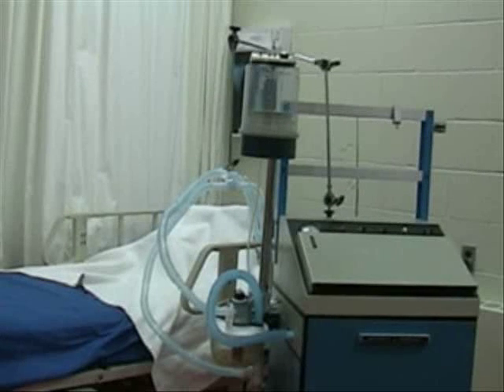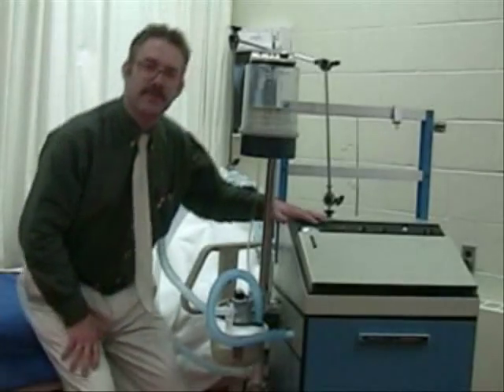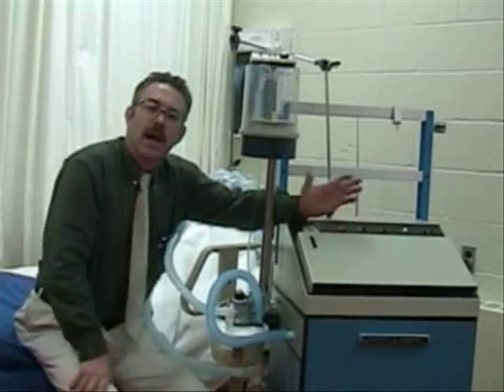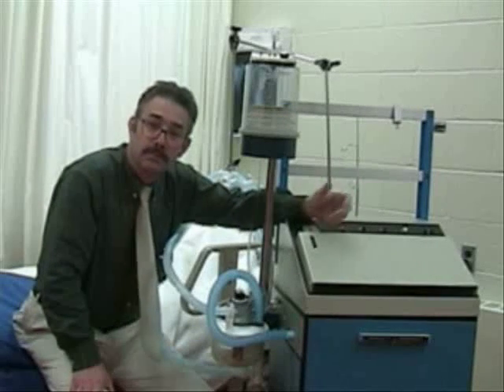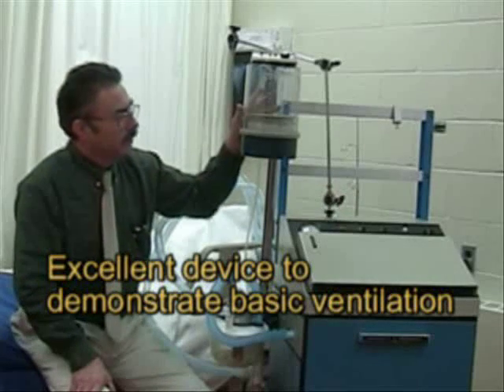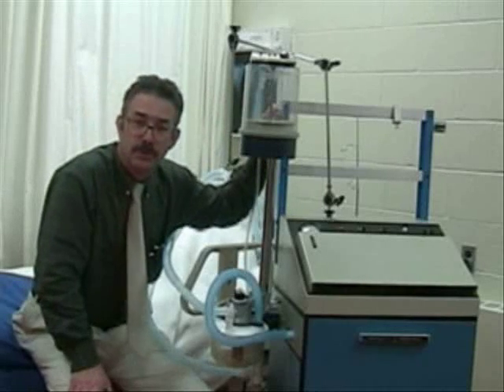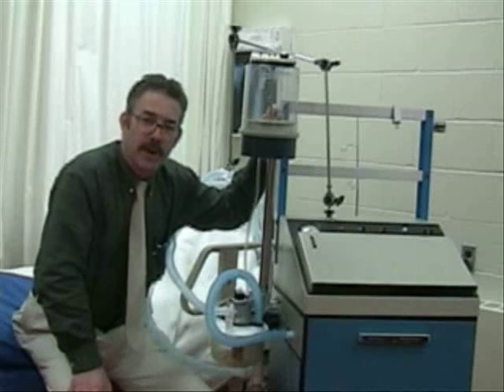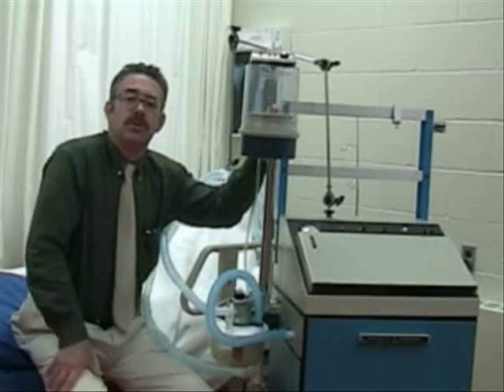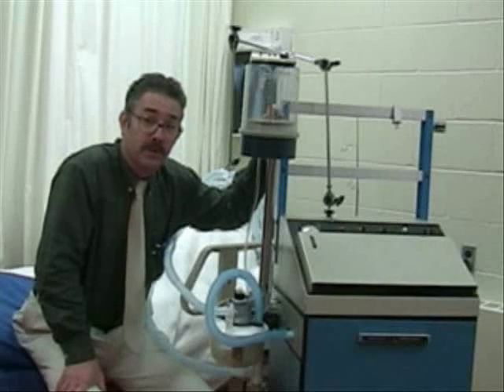The Puritan Bennett MA1 is one of the oldest ventilators, and from time to time you're going to see this ventilator — probably not so much in clinical use, but you'll see it in medical shows because it's a very visual ventilator. You can see the rising and falling of an exhaled spirometer, and it makes a lot of noise. You can hear the breath going in, versus some of the newer ones that are extremely quiet.